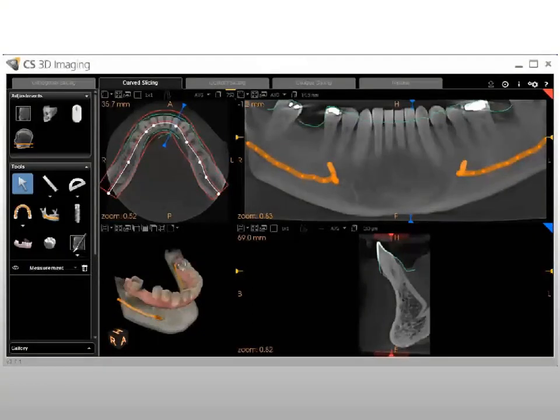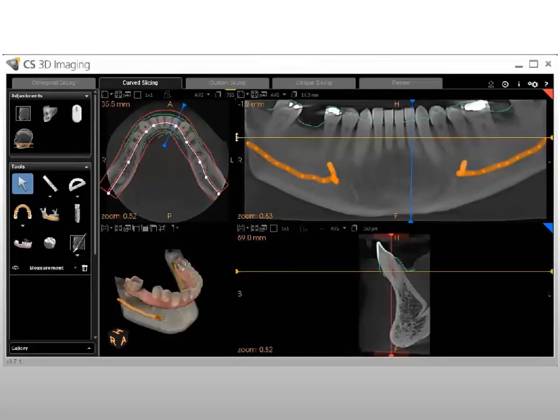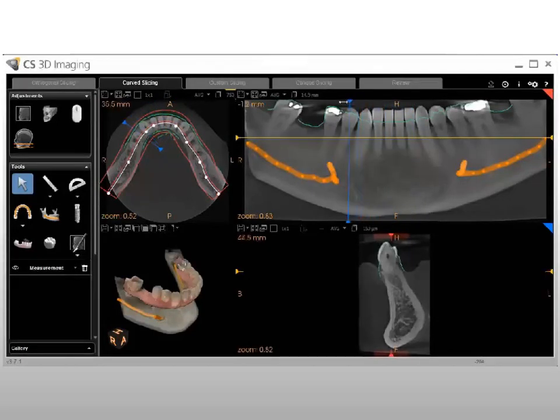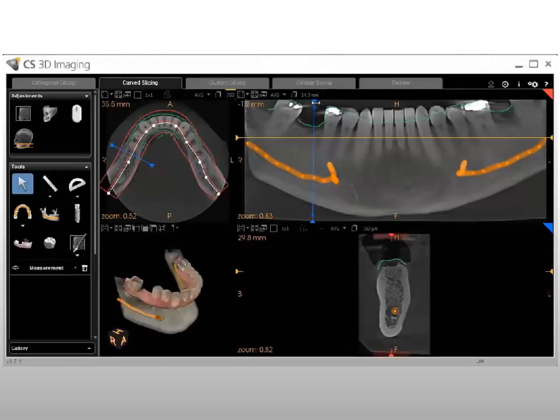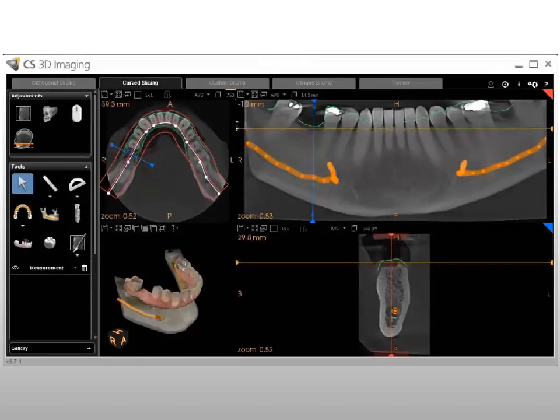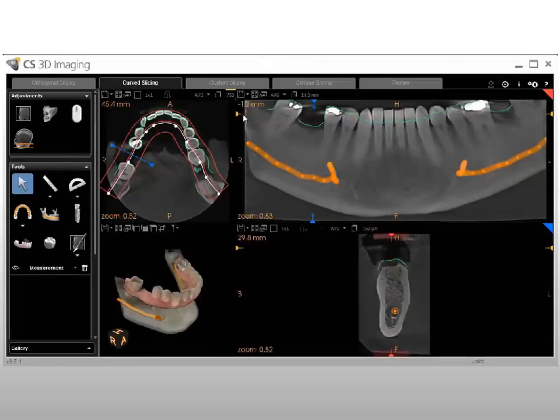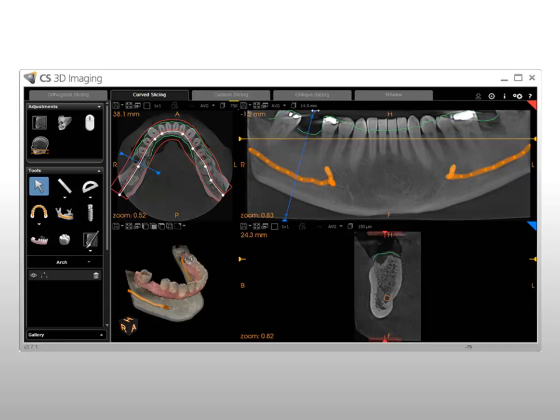To select the initial crown position, use the yellow and blue grab handles to adjust the position of the axial slice plane in the panoramic and oblique coronal view screen. To optimize crown placement, set the blue vertical grab handle of the axial plane at a right angle in the reconstructed panoramic view screen, and set the yellow horizontal grab handle with reference to the occlusal plane and the position of the adjacent teeth. When the optimal position is chosen, click the Crown button in the Curve Slicing tab Tools panel.